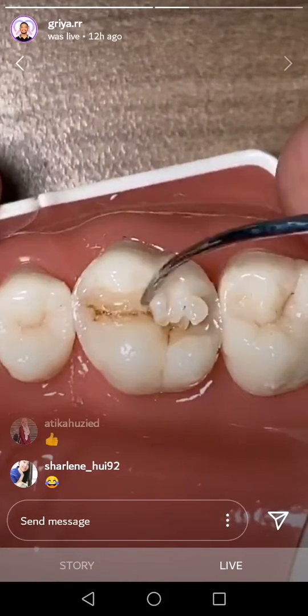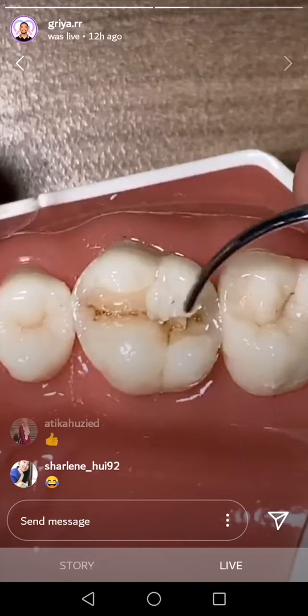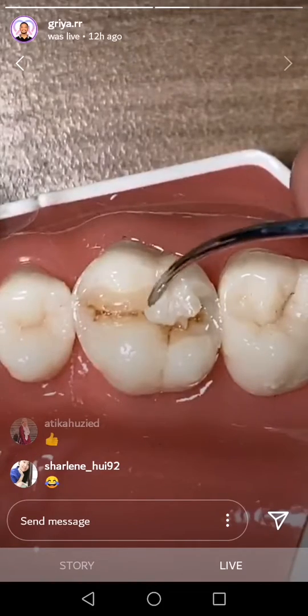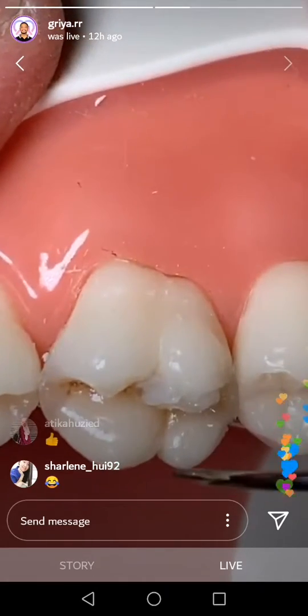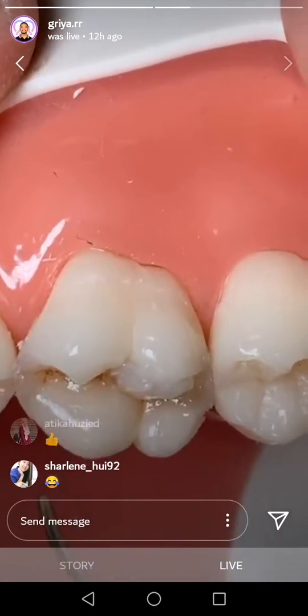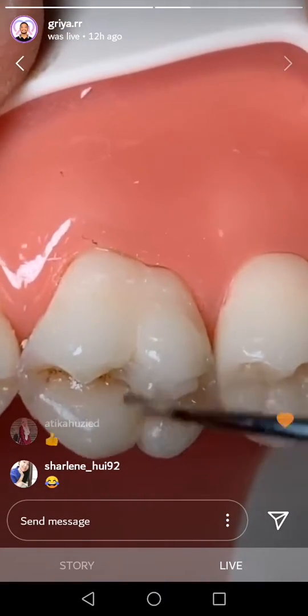Remember how to push. Oh, there's a hair. Push like this, yeah. Push like this to pop, not like this. This is round. Follow the curve, yeah. See, push.